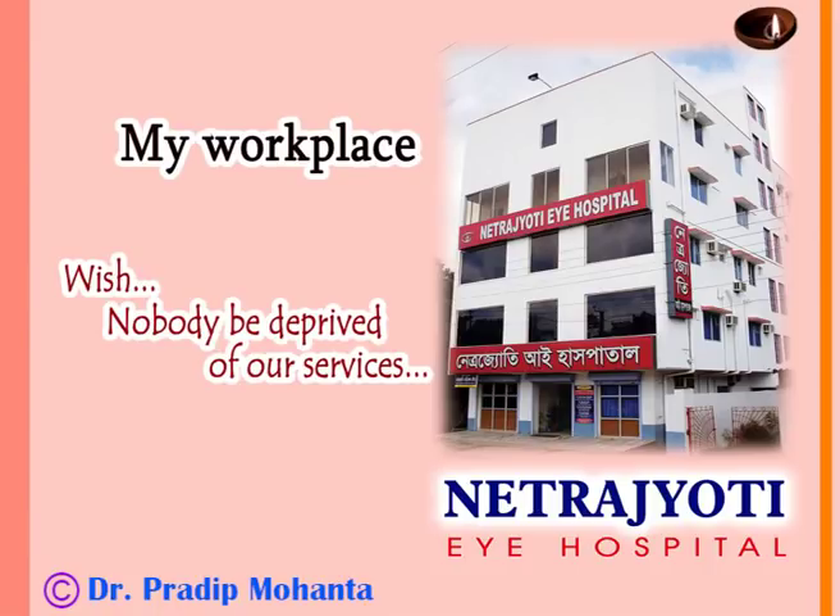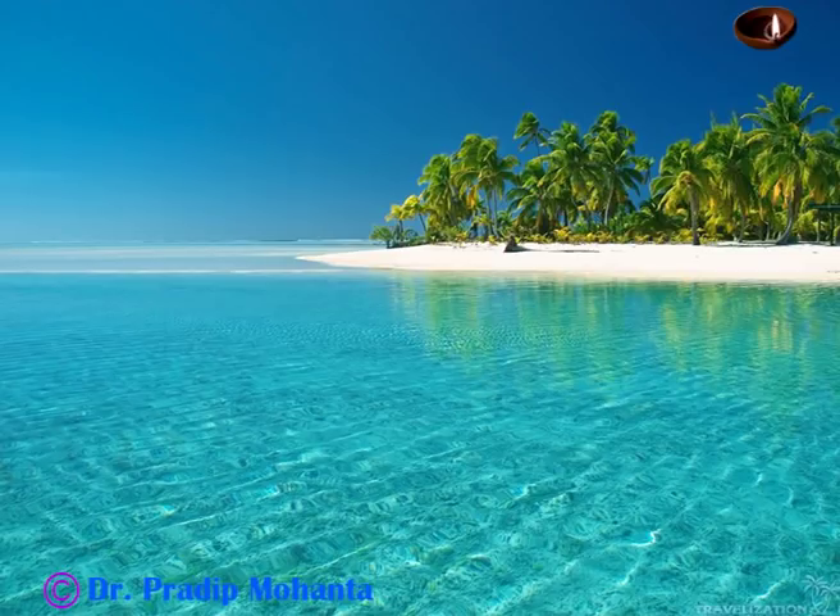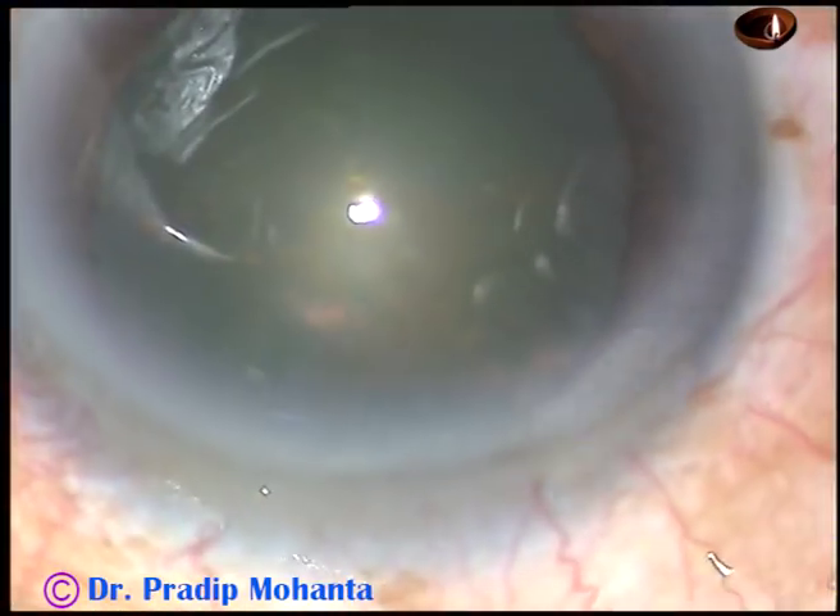Dear colleagues, welcome to my hospital at Ranaghat, West Bengal, India. In this video, I am going to share the stop and chop technique of phacoemulsification for young eye surgeons.